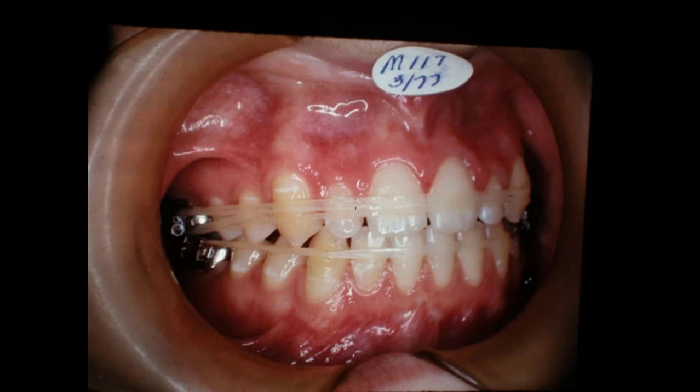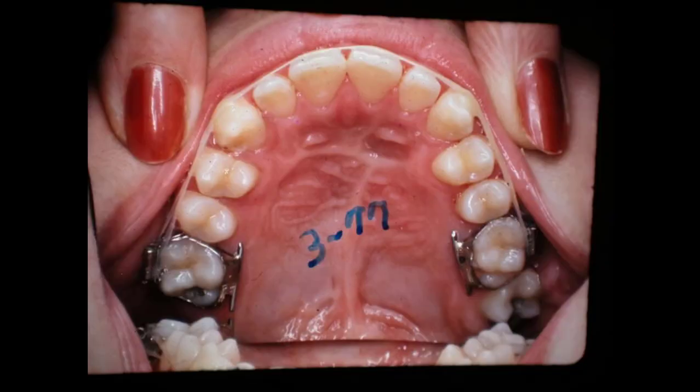Let's see if we can get those spaces together good and look at it a little bit. Now when I took this impression, you see it pushed down in there in that defect. Now we'll close those spaces up, and that's a mirror stuck in there, so these are the arches that you can see here.